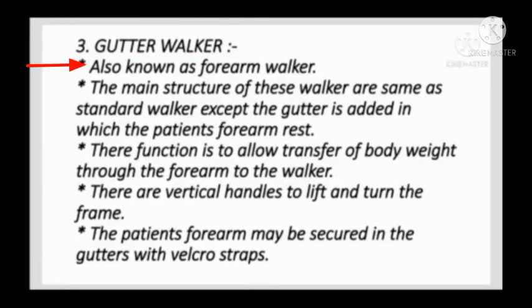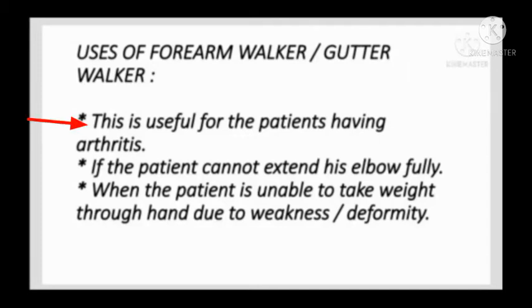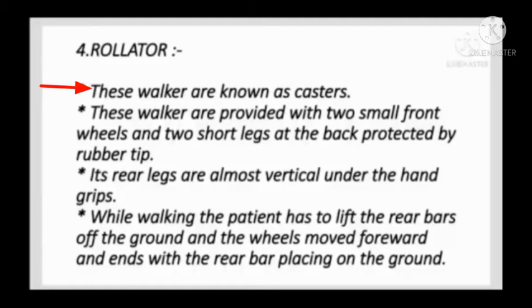Gutter walker, also known as forearm walker. The main structure of this walker is the same as that of the standard walker, except a gutter is added in which the patient's forearm rests. Their function is to allow the transfer of body weight through the forearm to the walker. There are vertical handles to lift and to turn the frame. The patient's forearm may be secured in the gutters with Velcro straps. Uses of forearm walker or gutter walker: this is useful for patients having arthritis. If the patient cannot extend his elbow fully, or is unable to take weight through the hand due to weakness or deformity, this walker is useful.